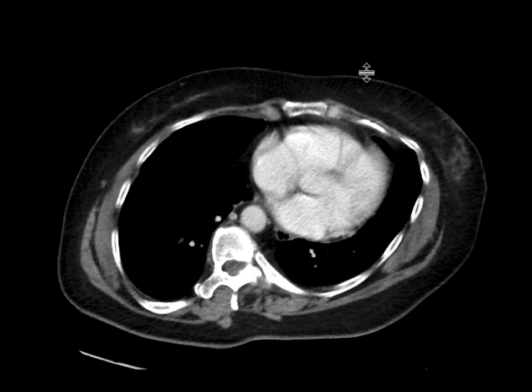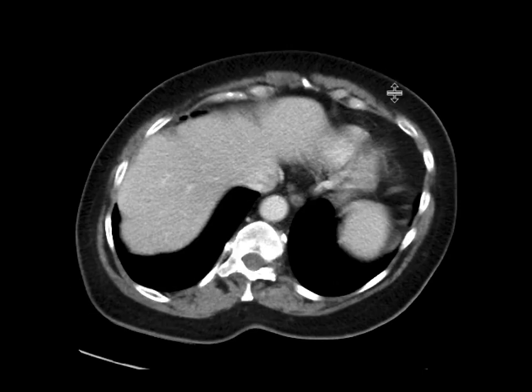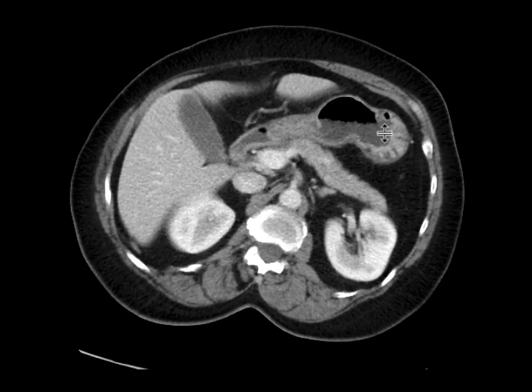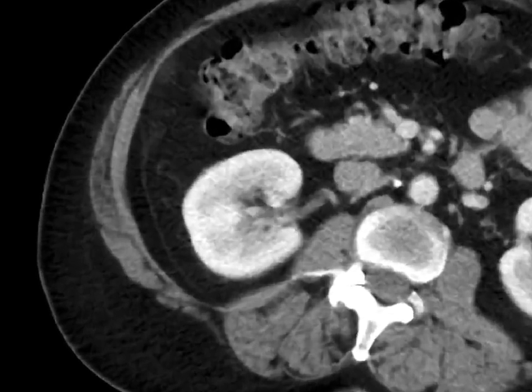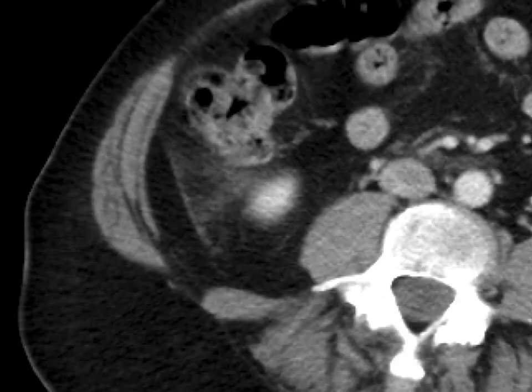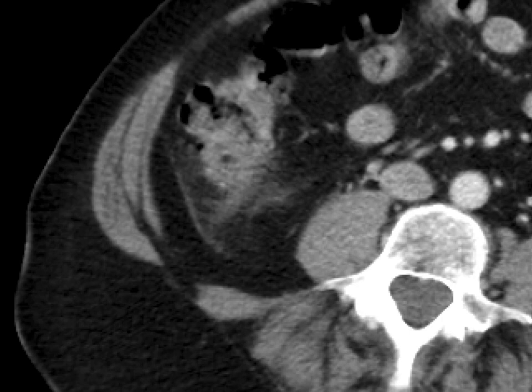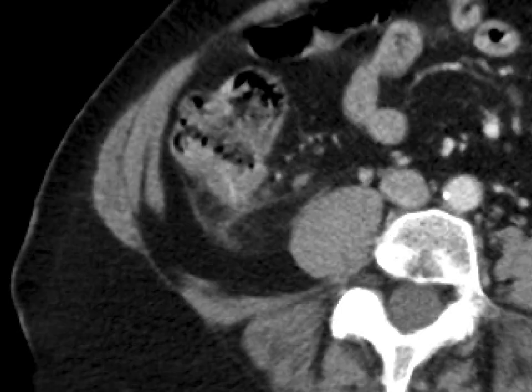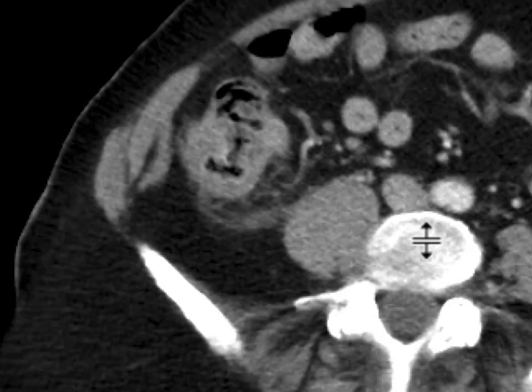This is a patient who came in with right lower quadrant pain after having had a meal a couple of hours before. The patient gets a CT scan with intravenous contrast, and as we scroll downwards, we're going to start to see some fluid, fat stranding, and some thickening of some of the fascial planes here in the right lower quadrant.